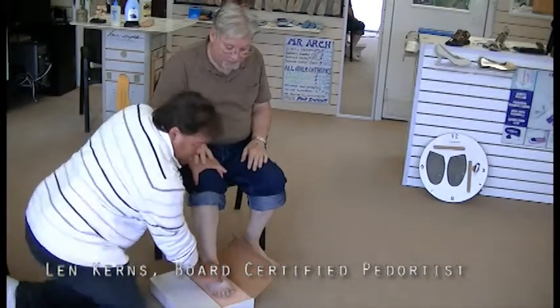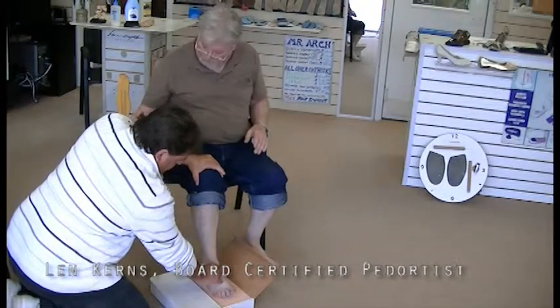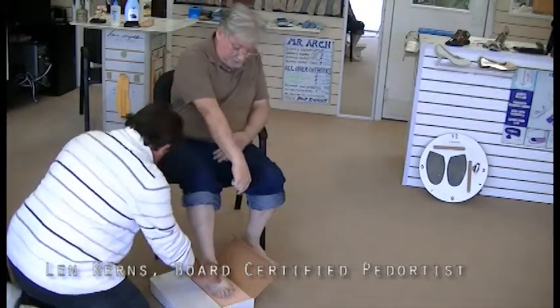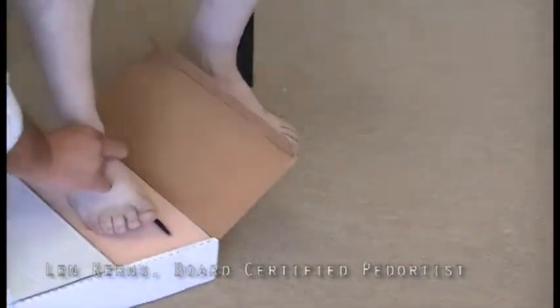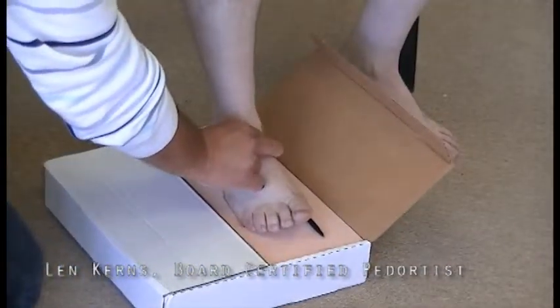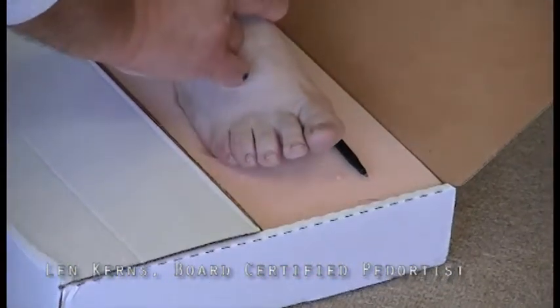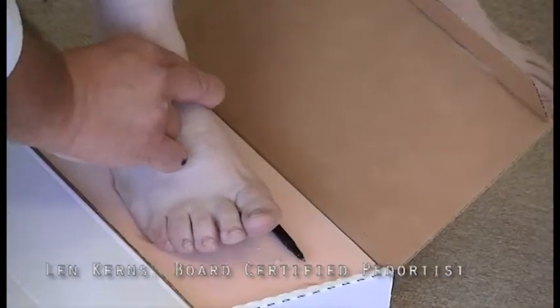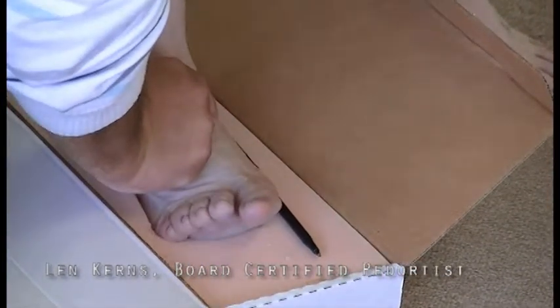Hold on, I'm coming right over it again. Let's ask the cameraman to use that pen, please. Just put the edge of the pen underneath my first metatarsal so that the doctors and the public can see, when he zooms in, how high it is off the foam. Now the secret is Mark's going to push the foot down, keeping that same angle after he gets the heel down.